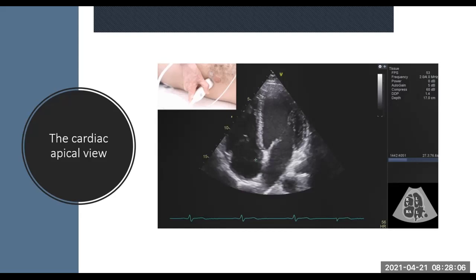Because you don't have many echo technicians, those echo technicians will use the cardiac probes. Each probe is 140,000 rand. So if you're lucky enough to work in an emergency department that has an ultrasound machine like us, the best you can hope for is the curvilinear probe that we have, right? Those straight probes, those are only for radiology, because that's another 200 somewhat thousand. So you don't expect those, all right?